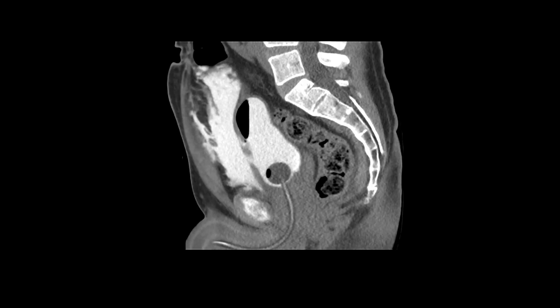Here is a sagittal CT-cystogram image where the bladder is filled with bright contrast material so that it is fully distended and any leaks become evident.